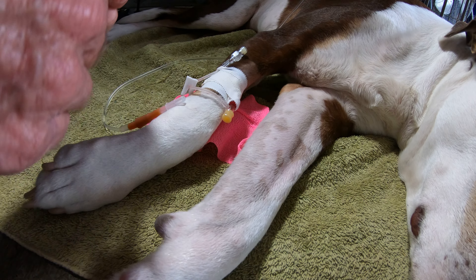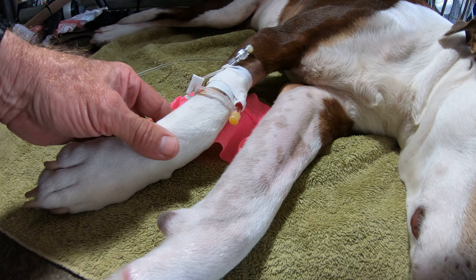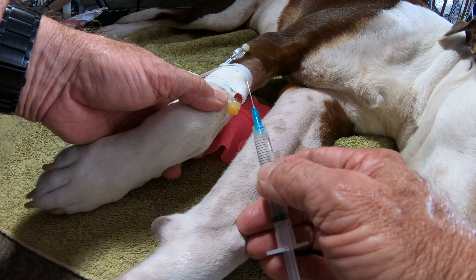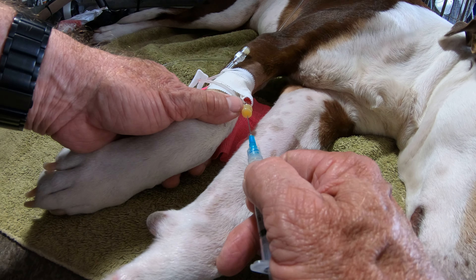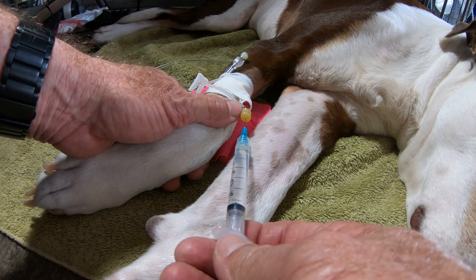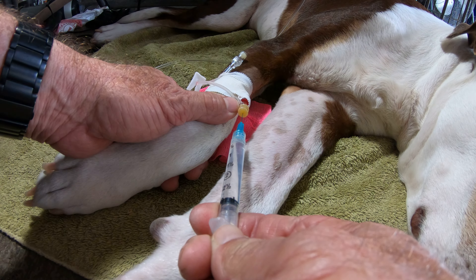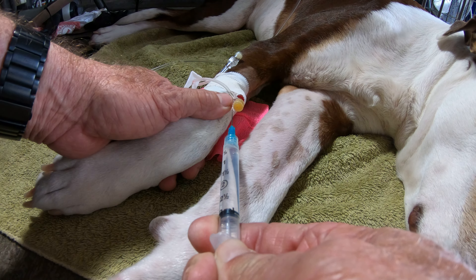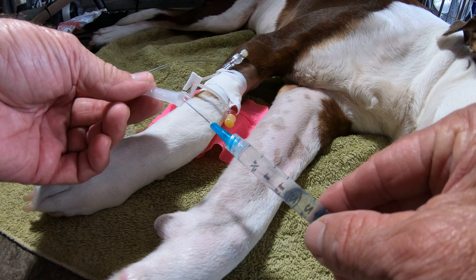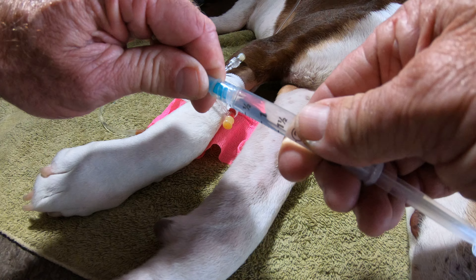This nipple has already been sanitized, and this syringe has been purged of air. Let me see if I can suck out that air bubble. There's an air bubble right here in this catheter, right at the end of this needle. I've got that air bubble — I took it out in this syringe, so I'm going to have to change the needle on this syringe.